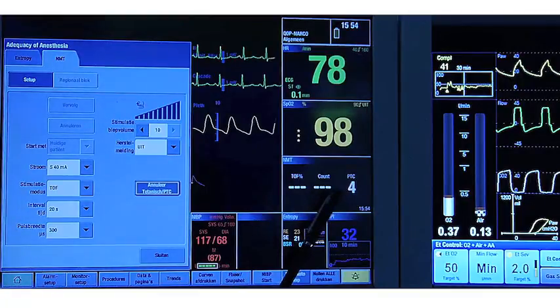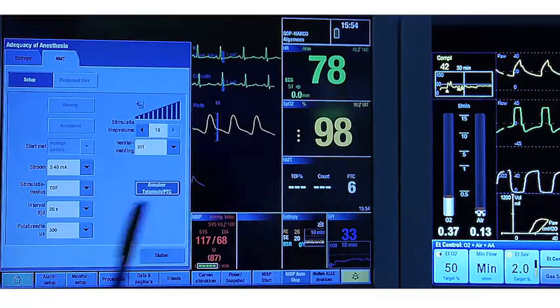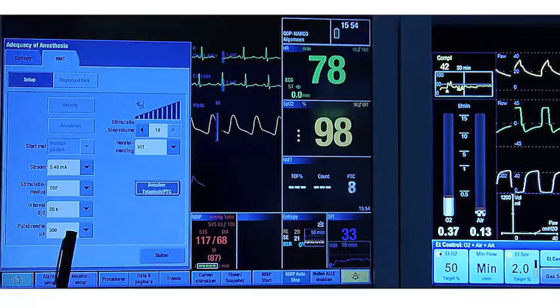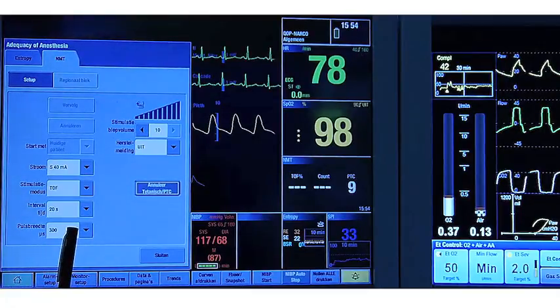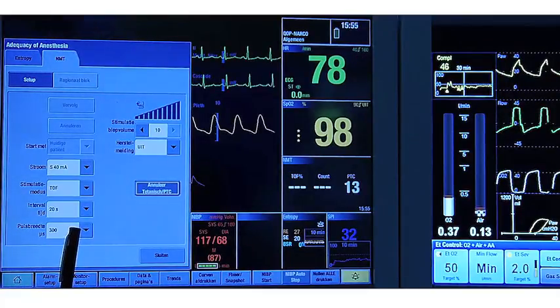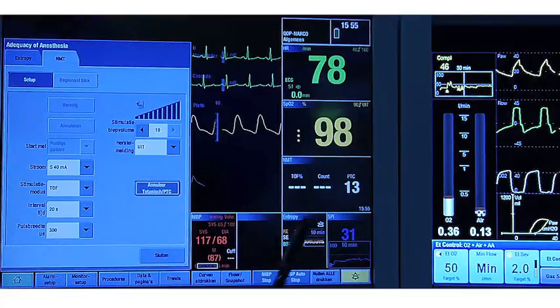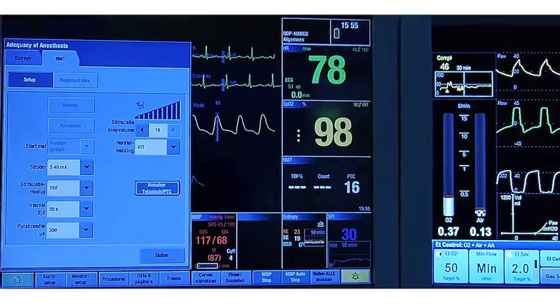You will see now that we get a lot longer answers because the pulse width is 300 microseconds and now we get a full answer of 14, 15.